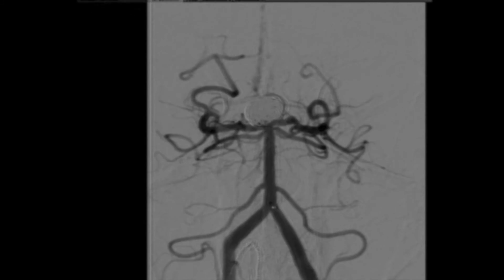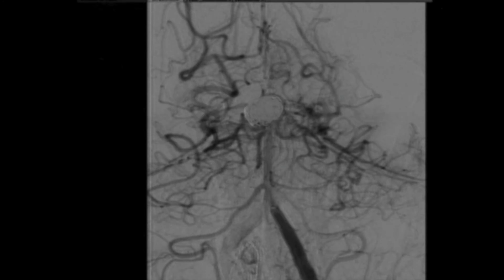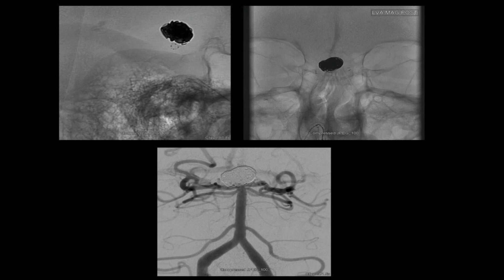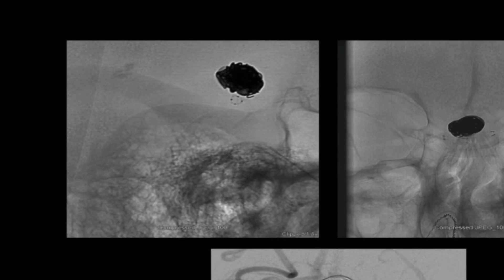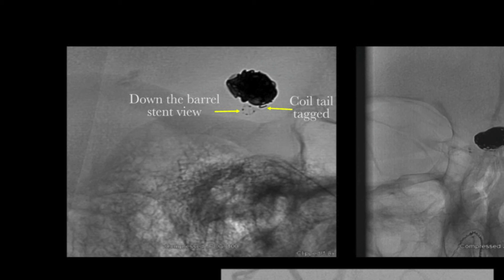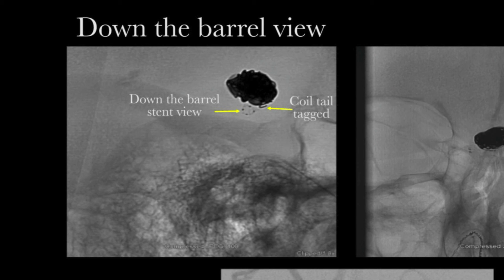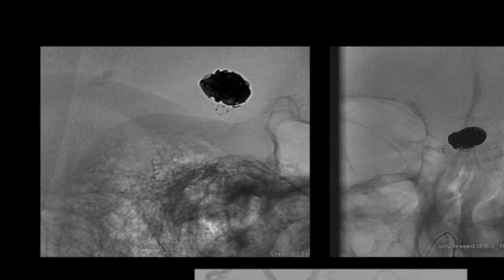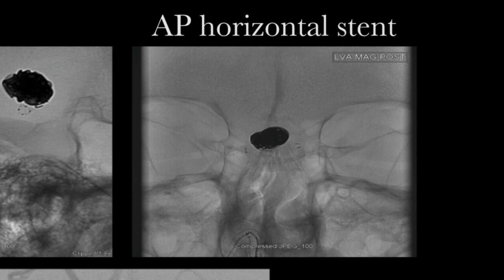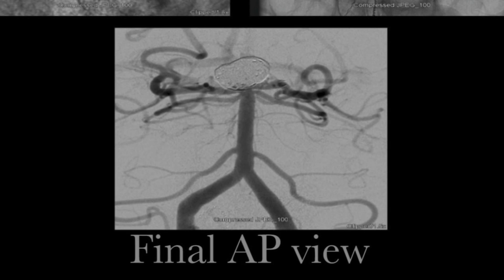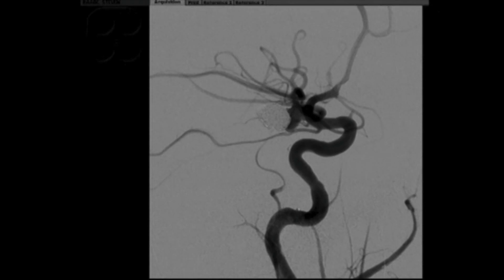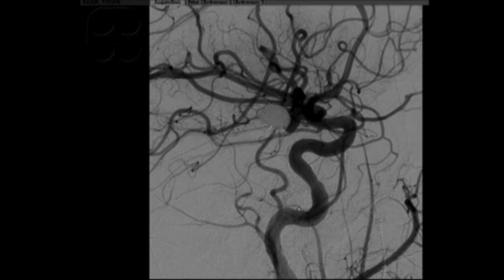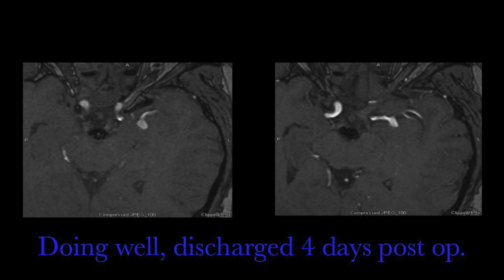Finally, on the left vertebral injection, we can see that the aneurysm is completely coiled and the stent is deployed from the left internal carotid artery. On this sagittal view, we can see the coil tail being tacked by the stent into the coil mass, and the down-the-barrel view through the stent. On the AP projection, the horizontal stent crosses from one PCA to the contralateral PCA, spanning the neck of the aneurysm. On the final angiogram, the left posterior communicating artery is patent, and on follow-up MRA one year later, there is no evidence of residual or recurrent aneurysm.